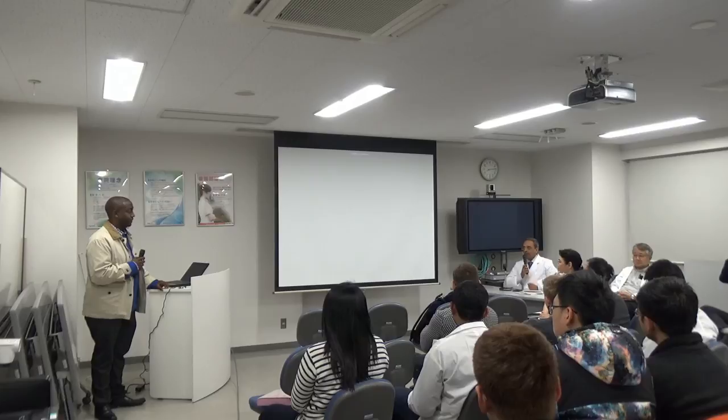The presentation is basically about intraventricular findings. Third ventricular findings are seen in neuroendoscopy in patients with hydrocephalus. What he wants to stress is the changes in ventricles which are suggestive of infection in the past. The infectious etiology being common, as he says, these are the findings. It's a point to be noted that where he practices, these things are very commonly seen in third ventricular endoscopy.